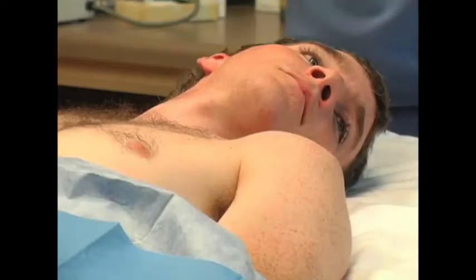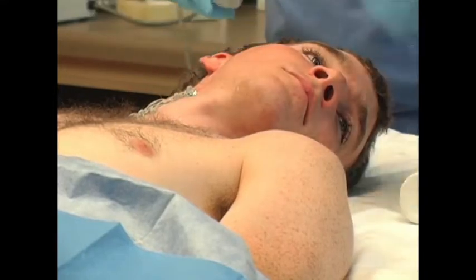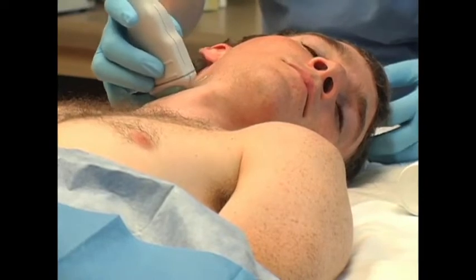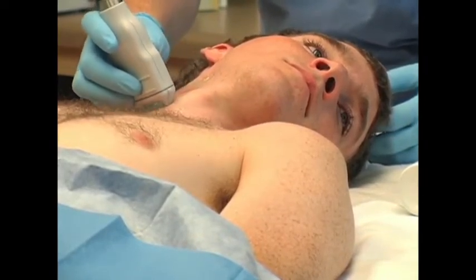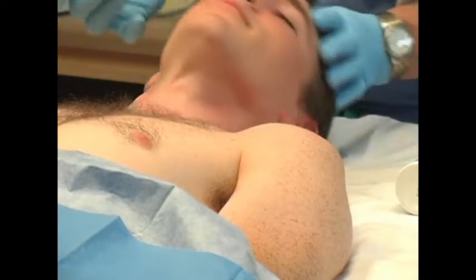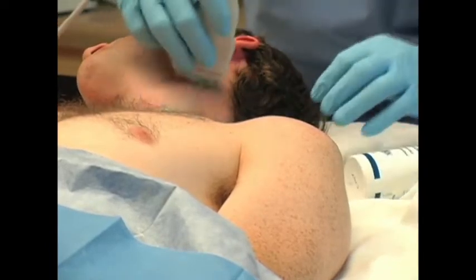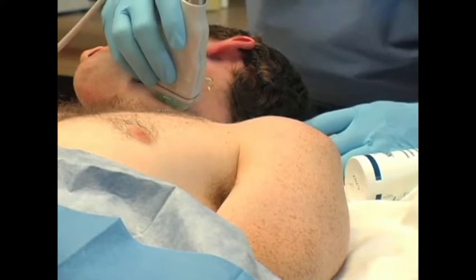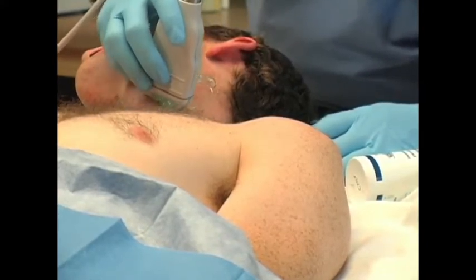Prior to an attempt at cannulation, both the right and left internal jugular veins are examined by ultrasound using the linear transducer for size and patency. The vessel is compressed to make sure that there's no clot in it, and we examine it for its overall size. Once we've looked at the right side, we'll look at the left side. Traditionally, the right IJ is preferred. However, if it's very small, we may actually use the left internal jugular vein to place our line.